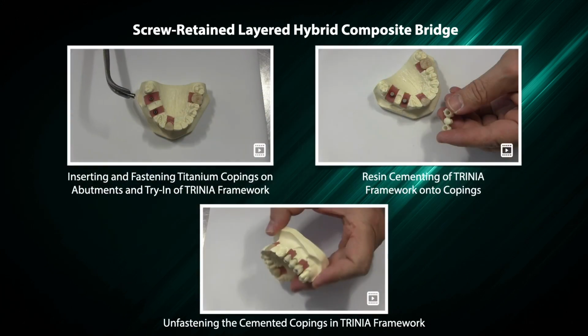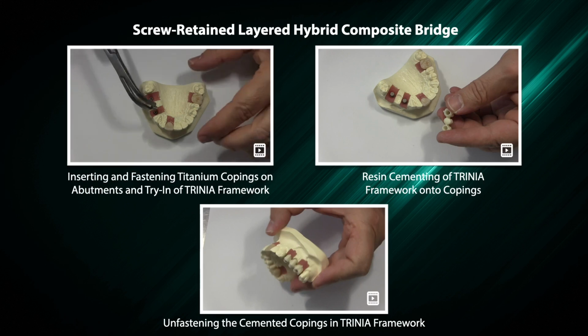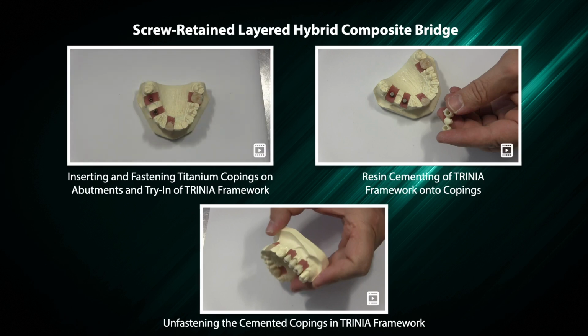Inserting and fastening titanium copings on abutments and try-in of TRINIA framework.